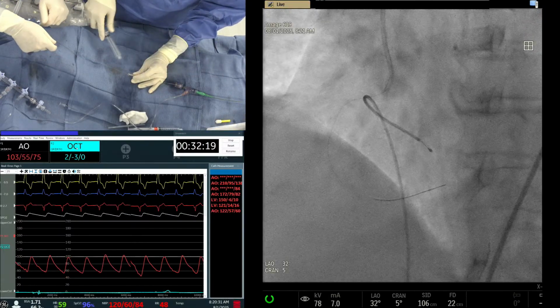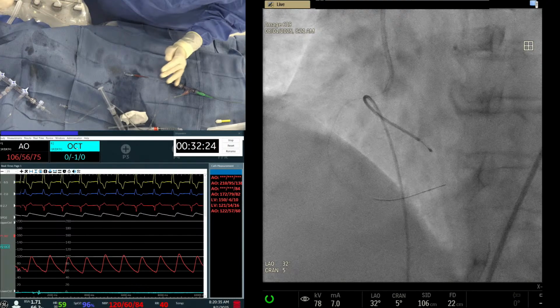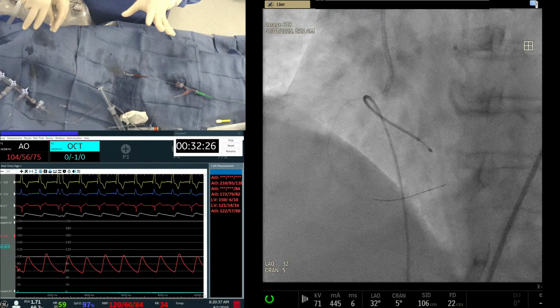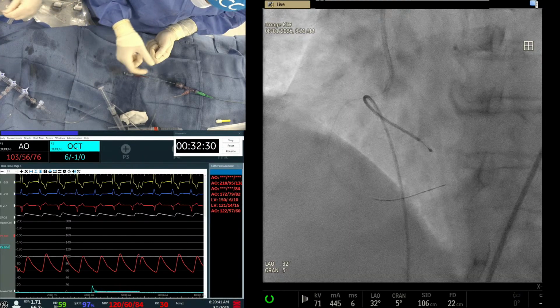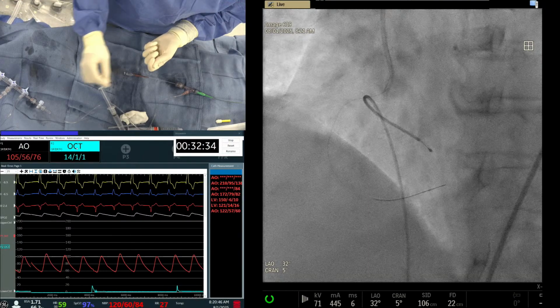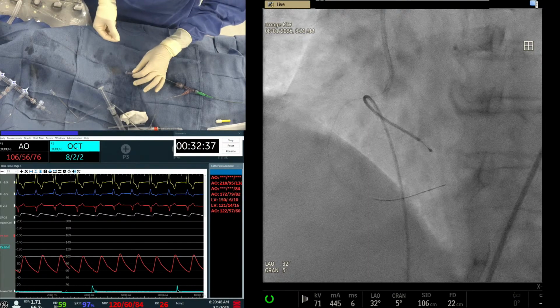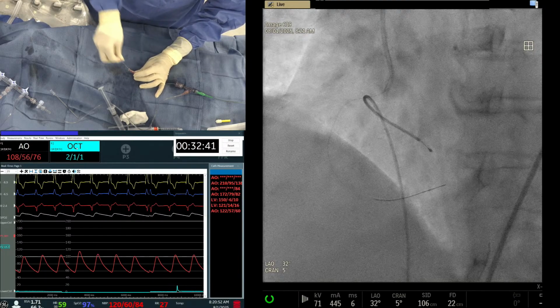Okay. We call this a cliff angioplasty. You understand? It's like you're hanging, the guide is barely giving us any support. And the imaging element is at the distal radiopaque marker, correct? Nothing beyond that.